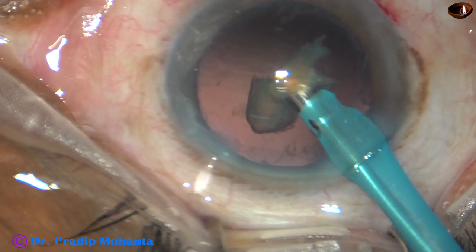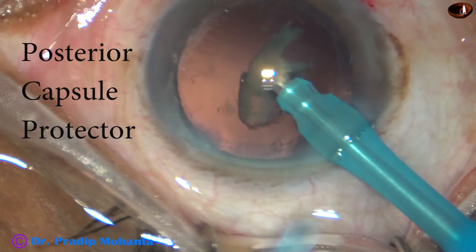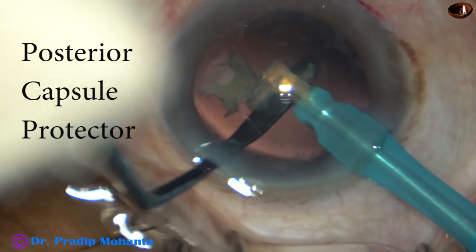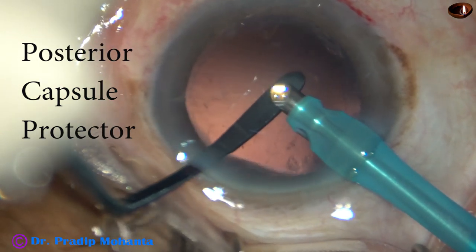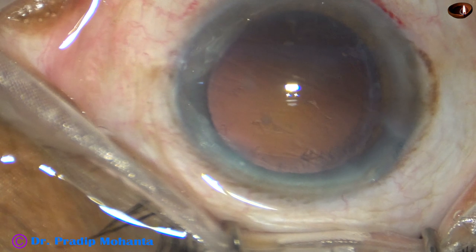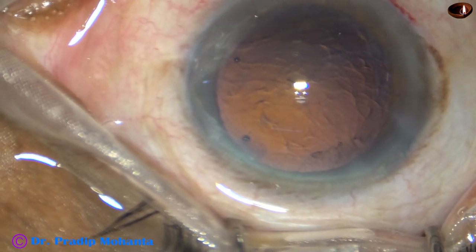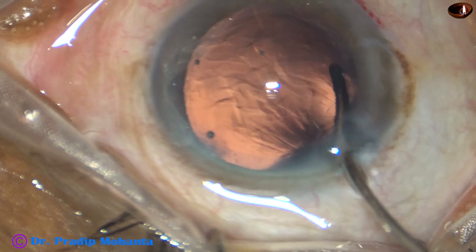I have divided this last part into two, but I don't want to take any more risk, so I am going to use this instrument designed by me — the posterior capsule protector. It has a curve which conforms to the curvature of the posterior capsule, and you get a lot of space just above this instrument to emulsify the nuclear pieces. You can keep the phaco needle at the iris plane and emulsify the piece, because the instrument is carved in such a way that it goes just into the position of the posterior capsule.